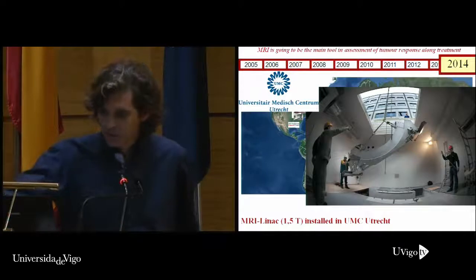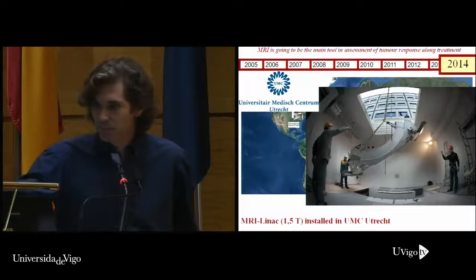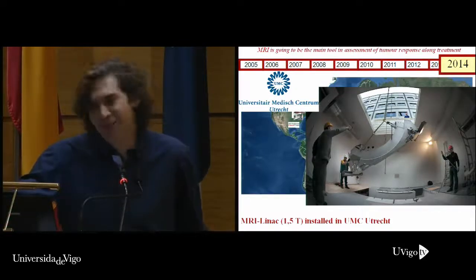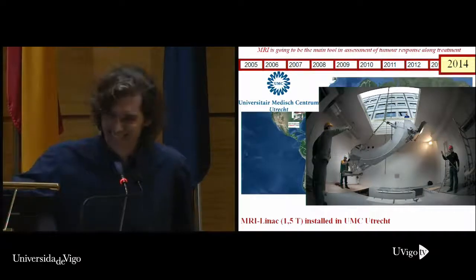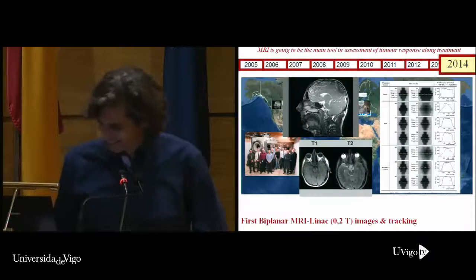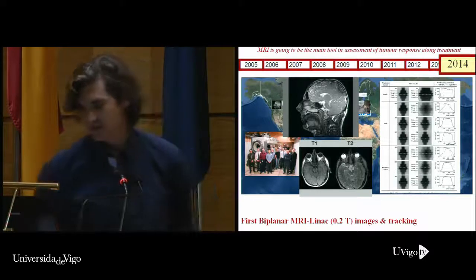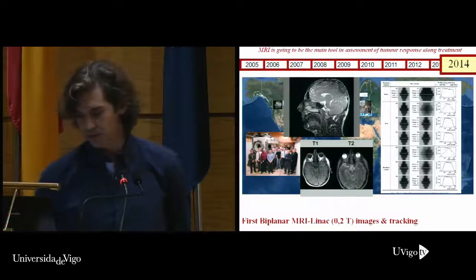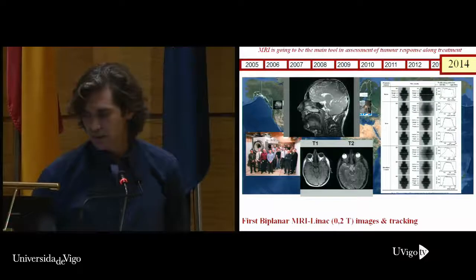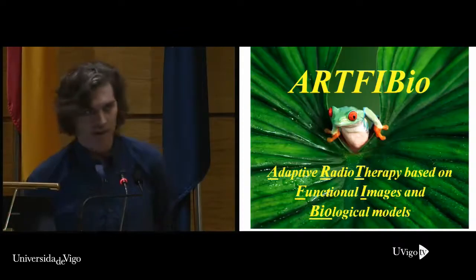And now the MRI LINAC is installed in the UMC in Utrecht, and probably in the NKI next month. Wow. It's not fast approaching, but it's approaching. Finally, this month, Tadic and Fallone published the result of the MRI images of humans with their biplanar MRI.